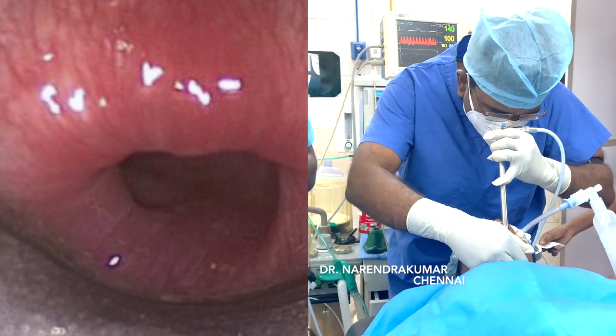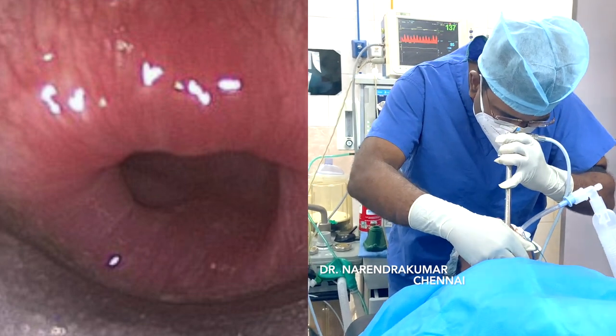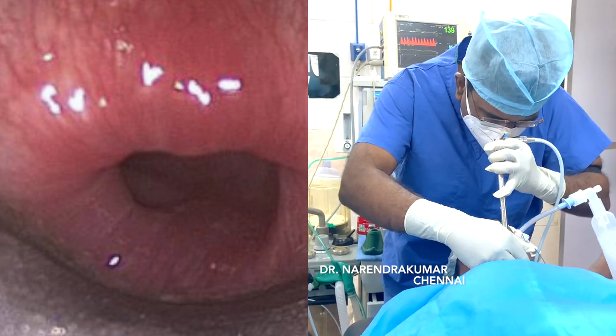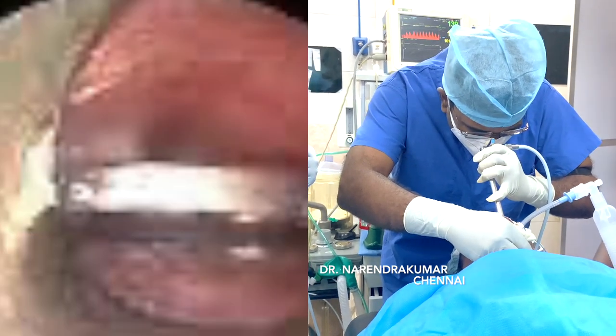After negotiating, you will see the cricopharyngeal opening — the esophageal opening. Insert just a little further inside and you will see the foreign body coin at that location.